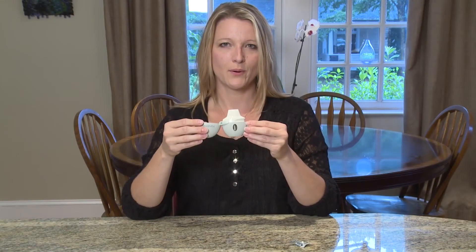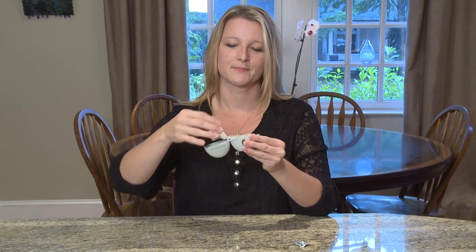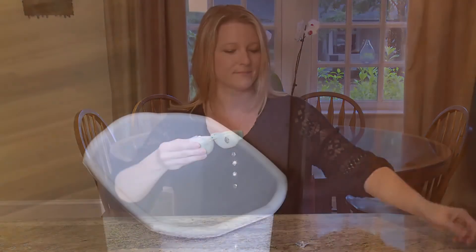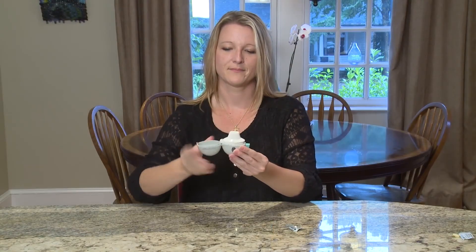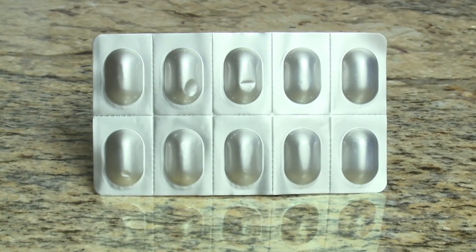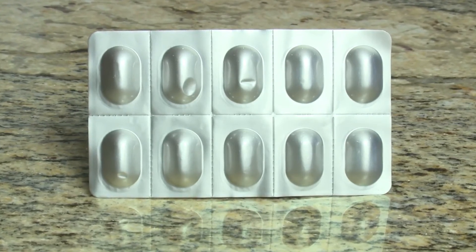After you have finished your treatment, open the mouthpiece and tip the Handihaler into your hand so that the empty capsule can fall out, then throw it into the trash. After you throw your empty medicine capsule away, close the Handihaler until the next time you need to use it. Check your capsule blister pack after every time you use your Handihaler to make sure you have enough medicine for the next treatment.